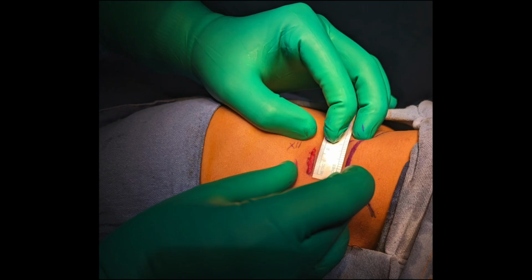All the port sites have good cosmetic outcomes. However, I would like to advise the youngsters to have a 1.8 to 2 cm long incision for camera port insertion in the beginning. Otherwise, you will struggle in the most crucial step of retroperitoneoscopic pyeloplasty. With time and experience, your incision size will automatically decrease to a 1.5 to 1.6 cm incision.